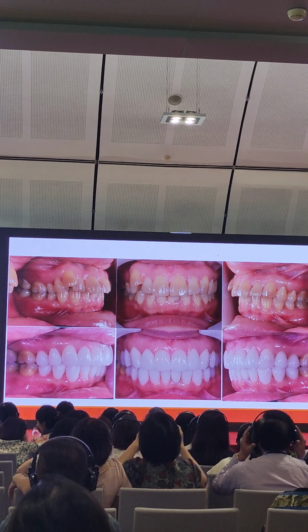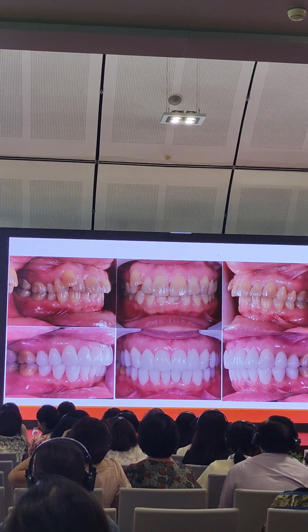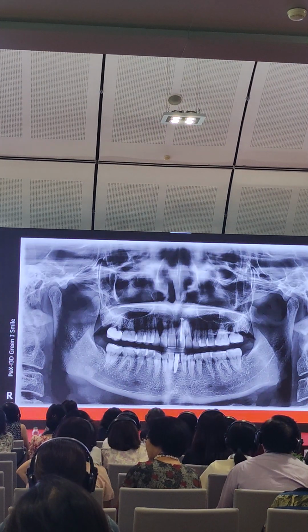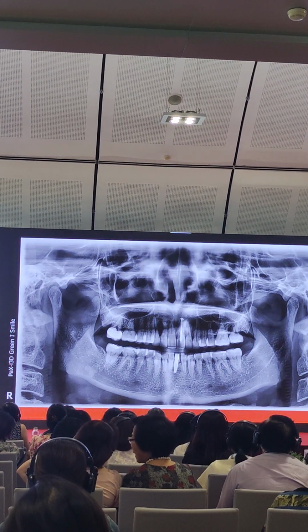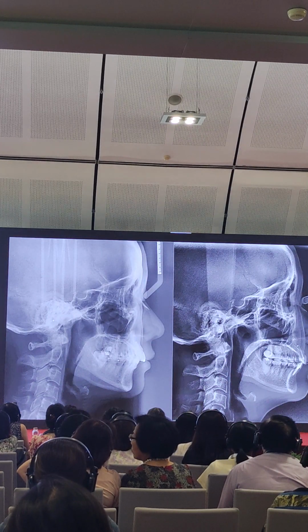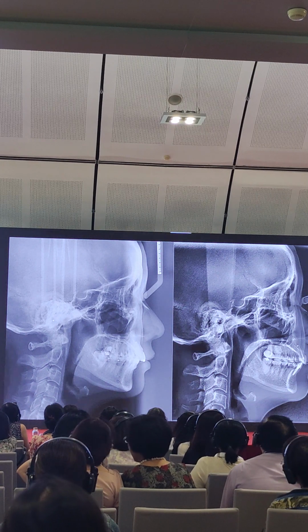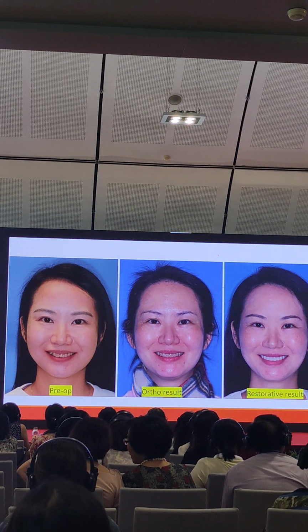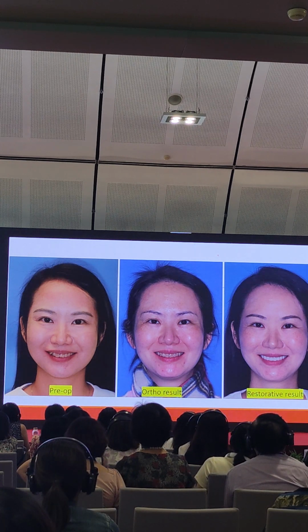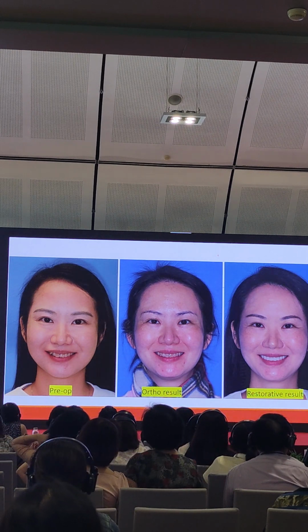Is it too white for you? It's very white. But no matter what, you have to discuss with the patient to select the color that she likes. Okay. So that is the change. After the change, for the orthodontic tooth movement, we distribute the space, we improve the occlusion and alignment, and prepare the site for our implant as well as for our final crowns. And that is after the orthodontic treatment, and that is after the restorative treatment.